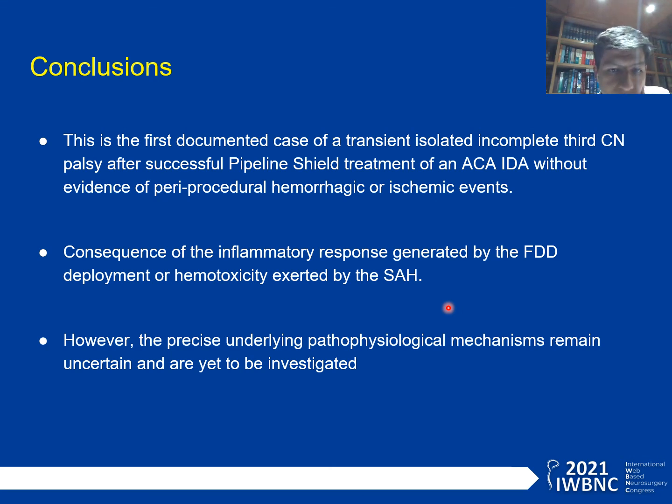We can explain this as an inflammatory response generated by the flow diversion device, or hemotoxicity associated with subarachnoid hemorrhage. However, this needs to be investigated further.